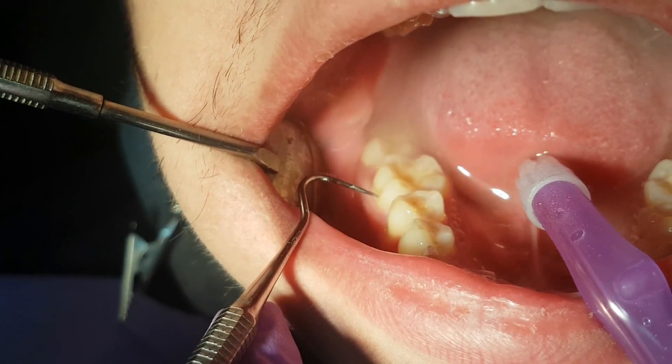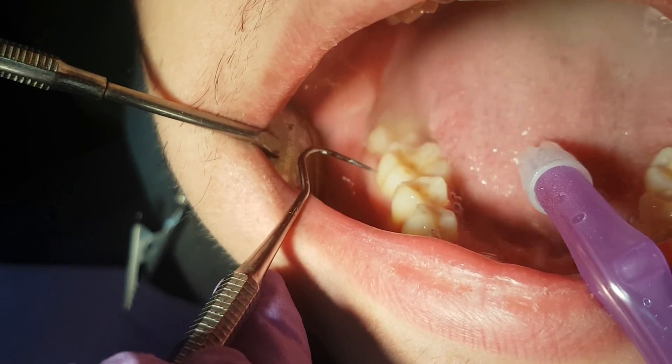We use the dental explorer to check if we have removed all the diseased tissue.